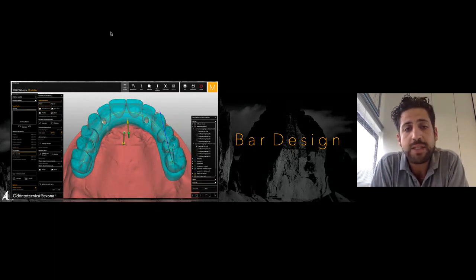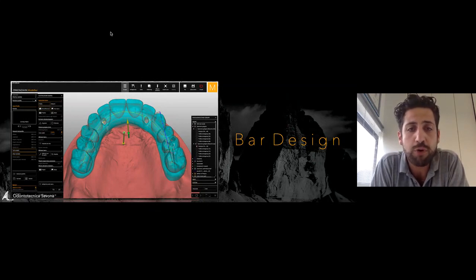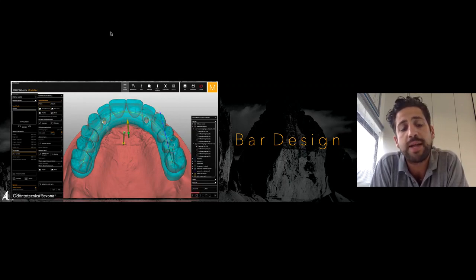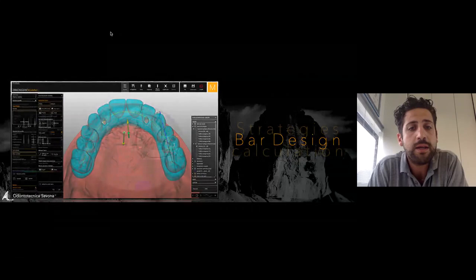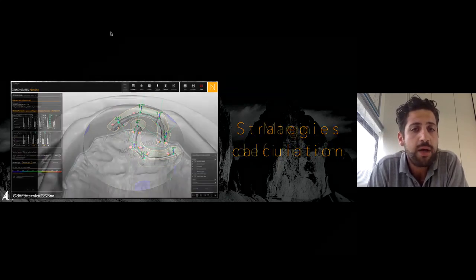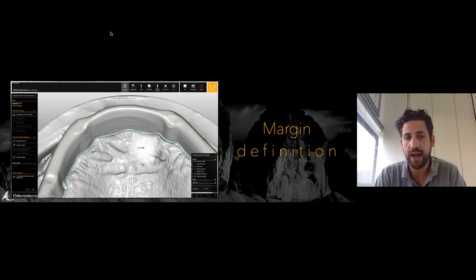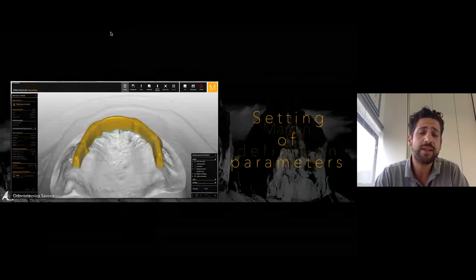We already had the two prototypes in our software, so we used the scan of this prototype as a reference to make the titanium bar. Okay. We made the strategy of this calculation for the titanium. We went to mill. After the milling, we scan the bar, and we take the bar as a single die.